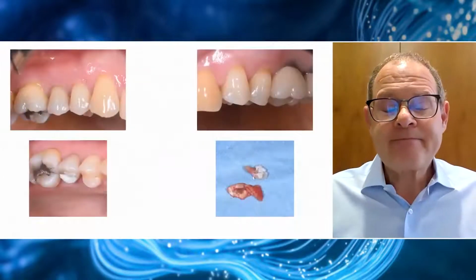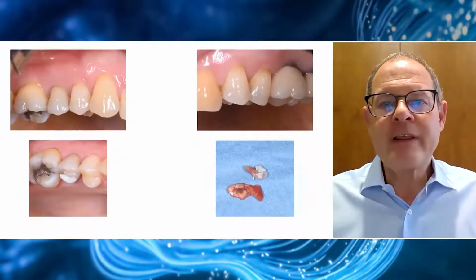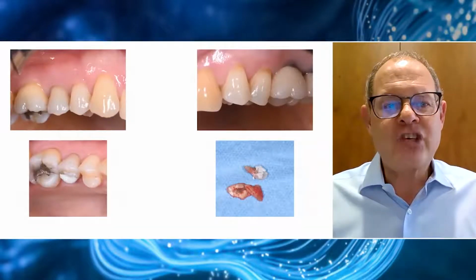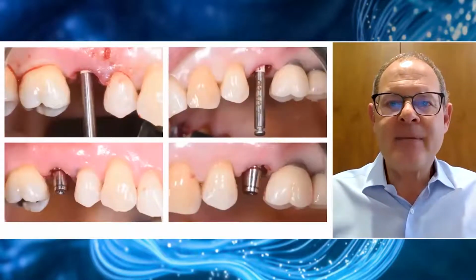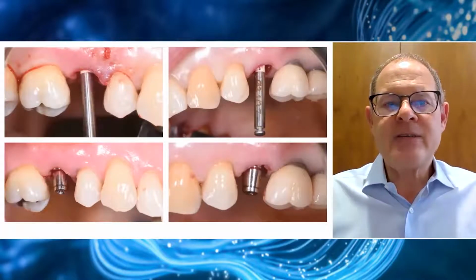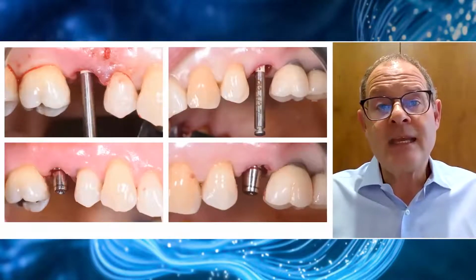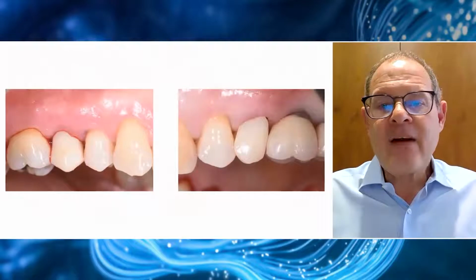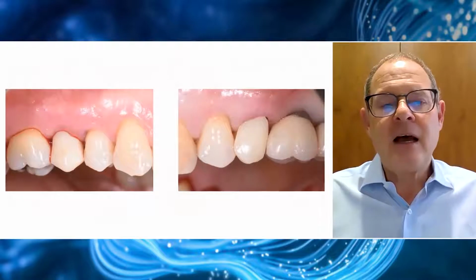Here's another example that I want to share very quickly. This is a patient who during the first COVID lockdown, under the stress of it all, managed to fracture 2 premolars. And so her bicuspids, her second bicuspids, one each side, were removed, and we proceeded with immediate implant placement. And my personal preference is to use the direct abutment as a temporary abutment. And then we fabricate hand fabricated temporary crowns using shells chairside.